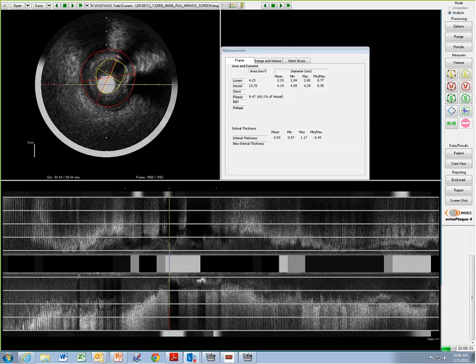Historically, what I have learned about BVS is that it has a tendency to recoil. This is a problem with very large vessels. Right now, I'm not going to argue with you about how to implement the BVS or not, and I think I agree.